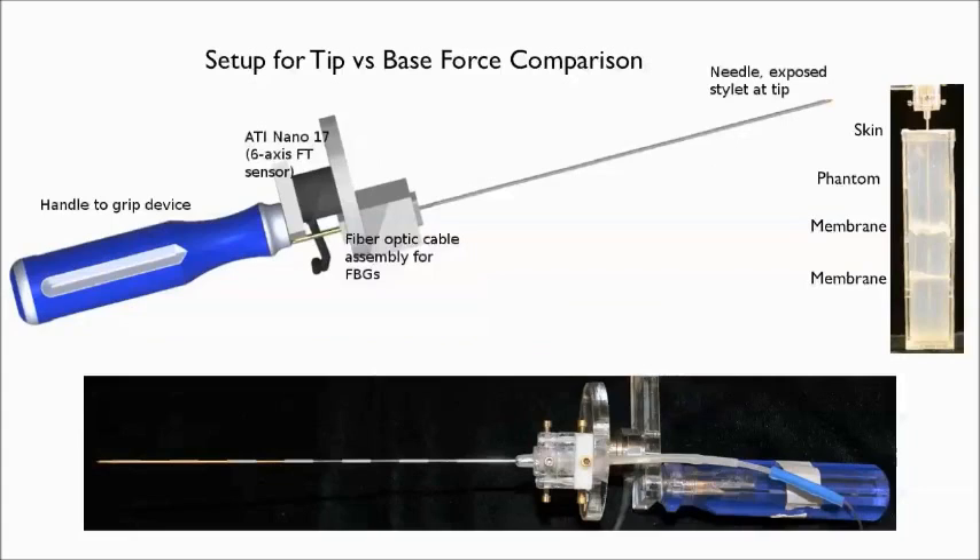We outfitted our MRI-compatible force sensing needle with a 6-axis force torque sensor at its base in order to compare loads felt at the base to those felt at the needle tip using embedded fiber optic sensing sensors.